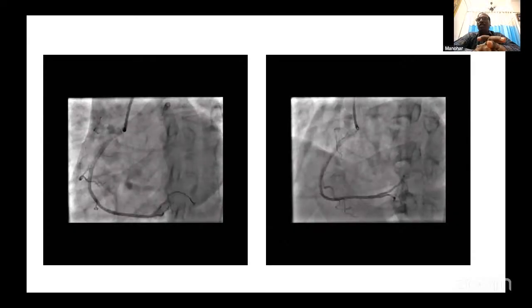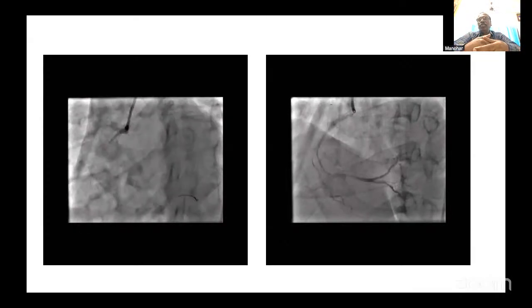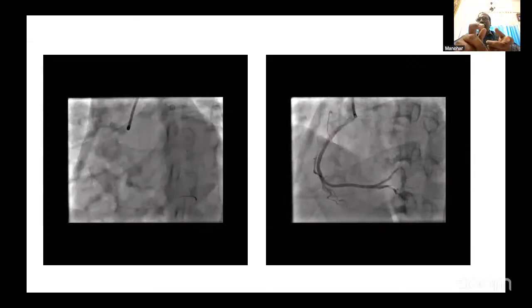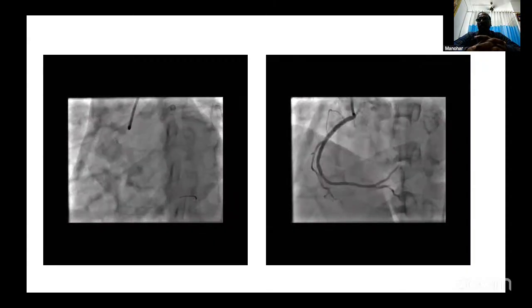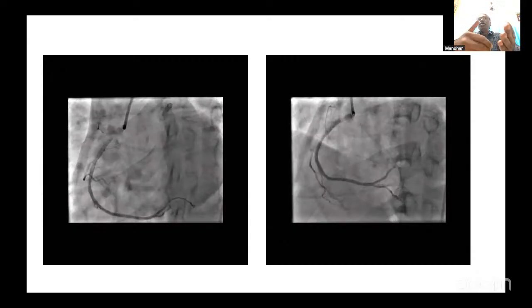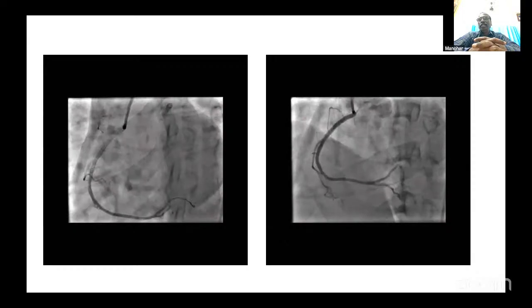Is it possible that in future imaging may be overlooked with these marker stents? I don't know, it may be. Suppose if we perfectly select the size of the stent according to the vessel size, after that there is no need for imaging. It may be useful. This is my observation with these stents. In future studies, if I add imaging, OCT as well as IVUS, how it will be useful for placement of the stent in the future course, I will decide.